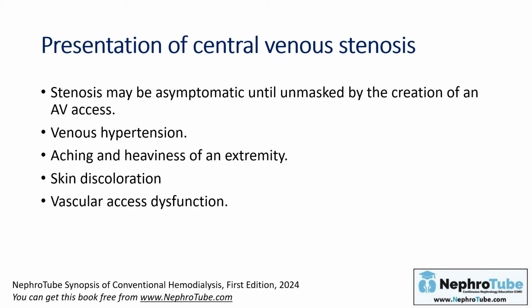Vascular access, if it is created in a patient with central venous stenosis, there may be vascular access dysfunction in the form of multiple high venous pressures on dialysis.